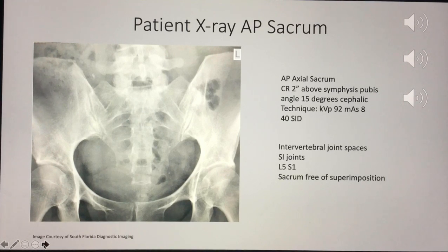Something important to consider with this type of images is to ask your patient if they want to stop by the restroom before we start the procedure, because when they have an empty bladder, you can visualize the coccyx better. It's also recommended to have the lower colon free of gas and fecal material, and require a cleaning enema. It's recommended, not mandatory, but it will improve the image, of course. You will see on the next slide what I mean.